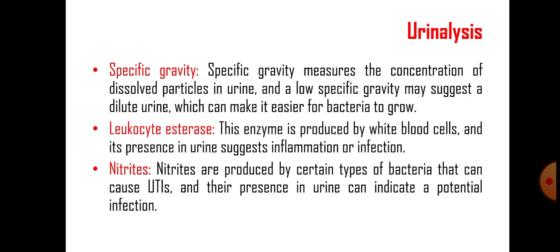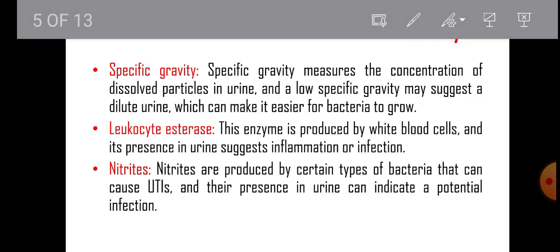Following are the tests like specific gravity and leukocyte esterase. This enzyme, leukocyte esterase, is produced by white blood cells, and its presence in urine suggests inflammation or infection. So leukocyte esterase is an example of a biomarker.